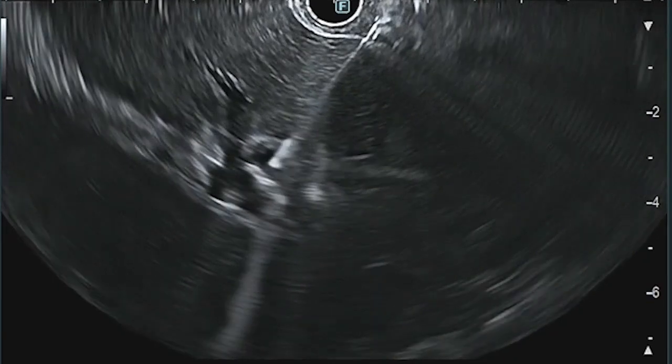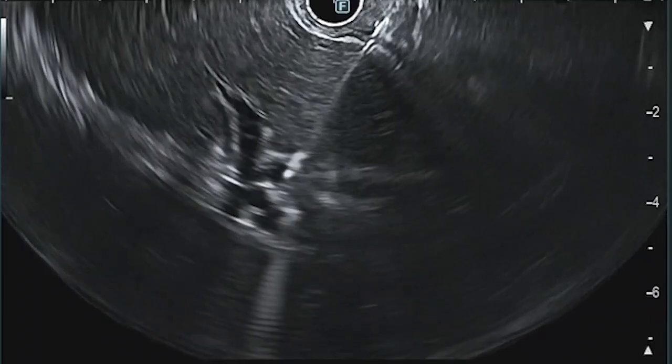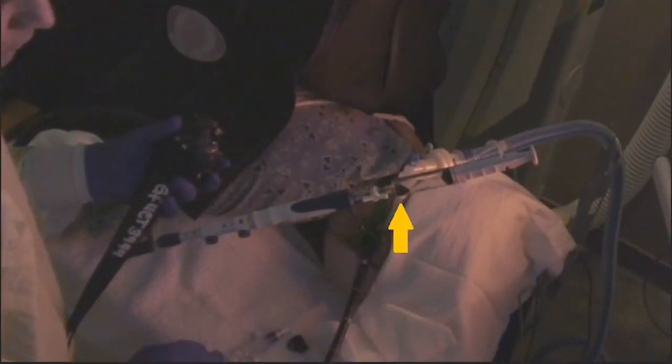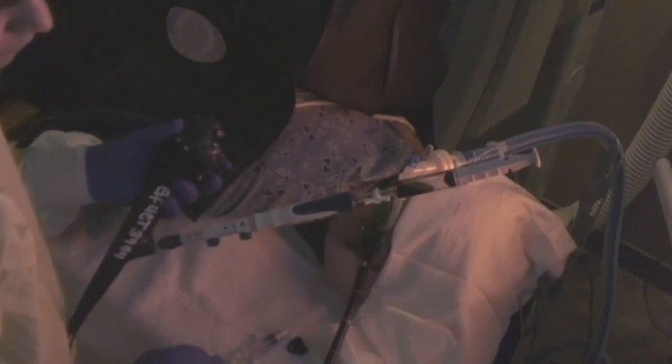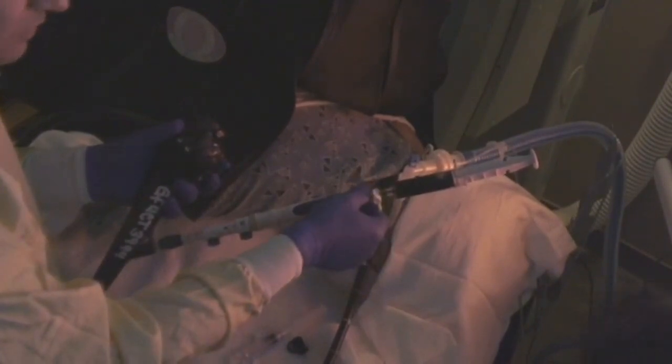If this does occur, apply suction when slowly withdrawing the needle until a bilious aspirate is confirmed. The biliary tree should be decompressed before the injection of contrast. This will reduce the risk of bacterial dissemination in patients with cholangitis and intraprocedural bile leaks. Aspirated bile may then be sent for microbiological studies.